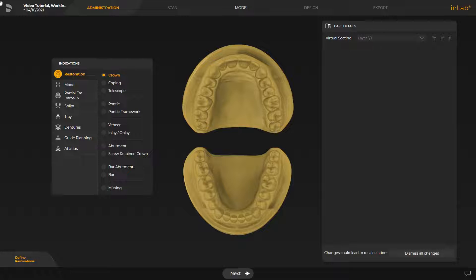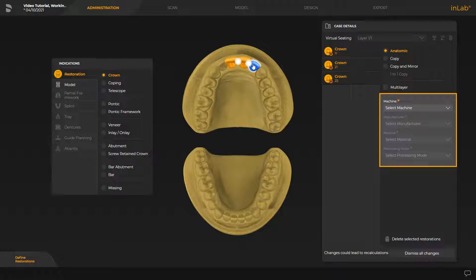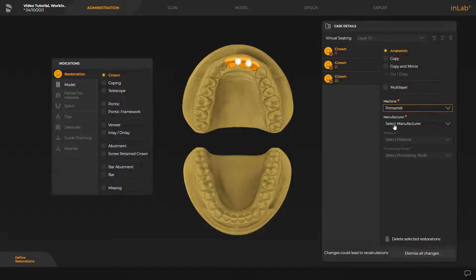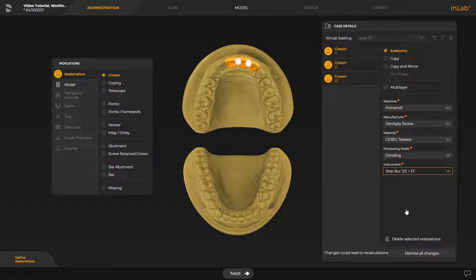Our model concerns three front teeth restorations in the upper jaw. To begin, we create these in the administration phase. Next, we define the necessary restoration information in the window under Case Details. To create a model, we now switch to the Model option under Indications.